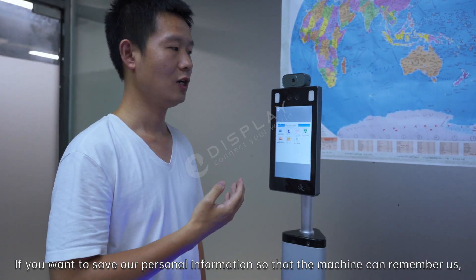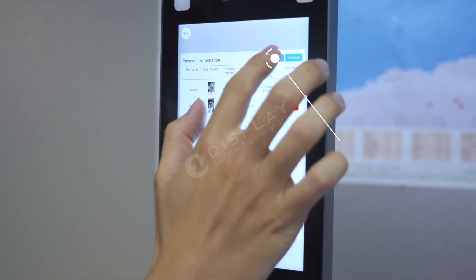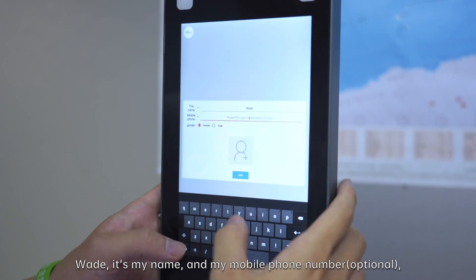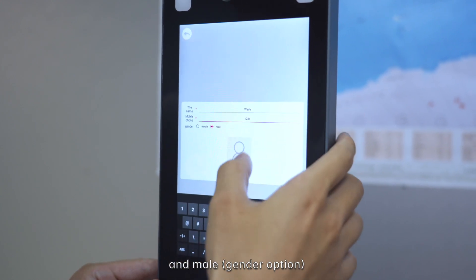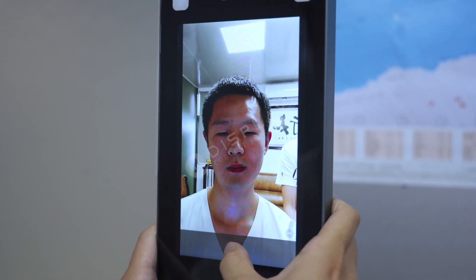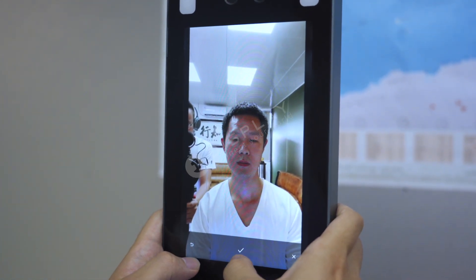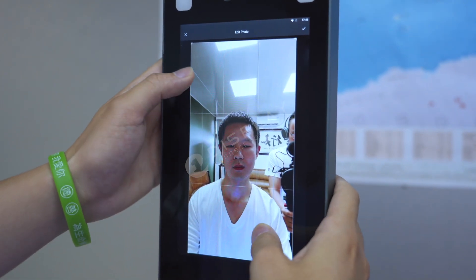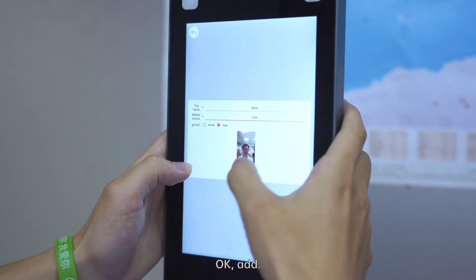If you want to save personal information so that the machine can remember you, press this. Here you can add personal information — your name, mobile phone number, and email. Add your photo. I'll take my photo right now. Save, then adjust to make it more clear. Add.